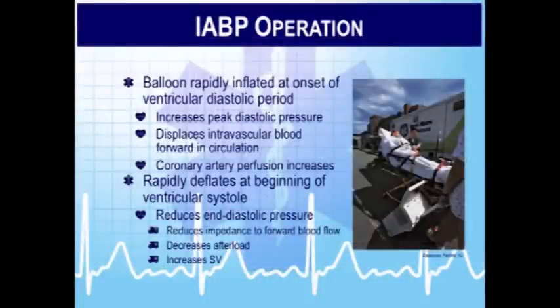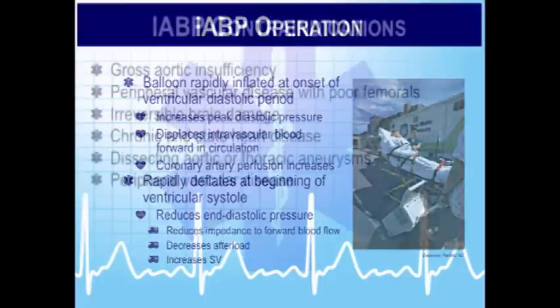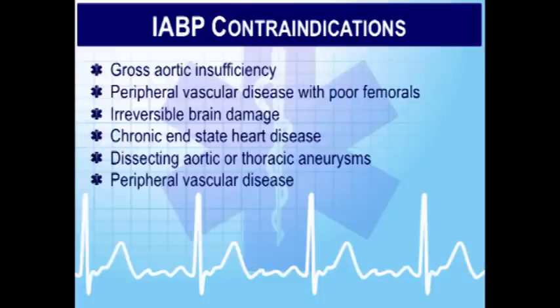On flight, they will sometimes take that device. You can see it's relatively portable looking. It's heavy though. They can strap that in on the helicopter. Flight actually has their own balloon pump, and it's not one of those Maquet devices, or at least it wasn't 5 years ago. I haven't asked in a while. It's a different kind of device, and quite frankly, it's not that sophisticated, at least it wasn't then. But it's much lighter, smaller, much more appropriate for the inside of a helicopter. I mean, that is like as much as another patient could weigh, right? So weight and balance and all that kind of nonsense can be affected. It's not nonsense. You know what I'm getting at.